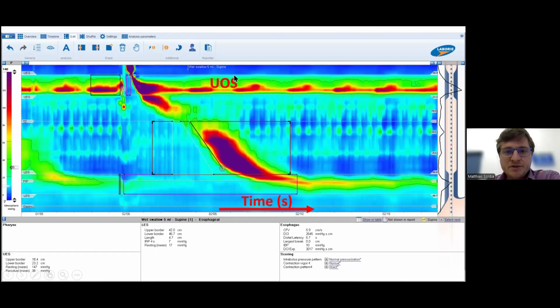Okay, so we've got time at the bottom, upper esophageal sphincter, and the lower esophageal sphincter below that. I hope that's quite clear. And what we do with these 10 wet swallows, we then analyze what the peristalsis is doing and what is happening to the lower esophageal sphincter, as I mentioned. That's the most important thing. Now you'll see all these other bits of changes in pressure that occur behind it. Those are artifactual. Remember, we're measuring pressure inside the esophagus, but it is influenced by pressure outside, most notably in the thoracic cavity. So the heart beating against the esophagus and the changes in inspiratory and expiratory pressure are represented here. So we essentially ignore these. This is not peristalsis. What you see here is not peristaltic activity at all.